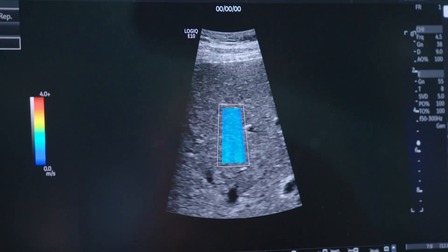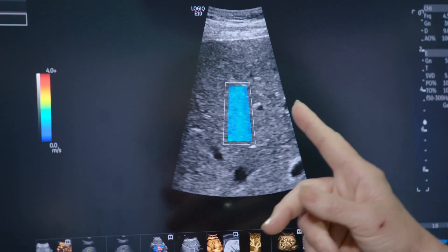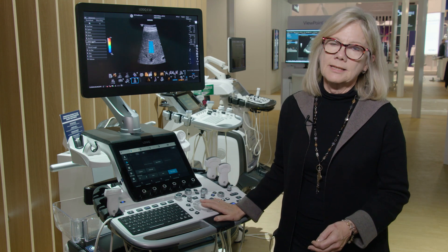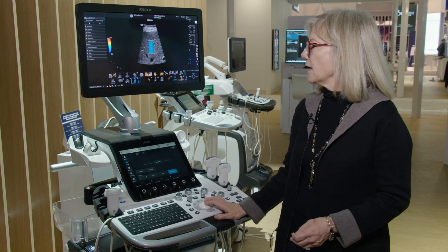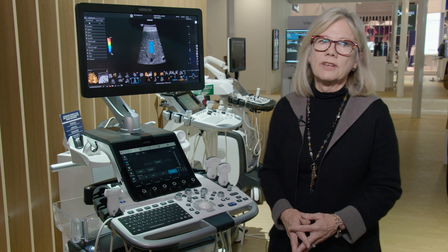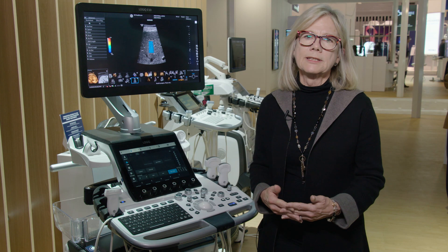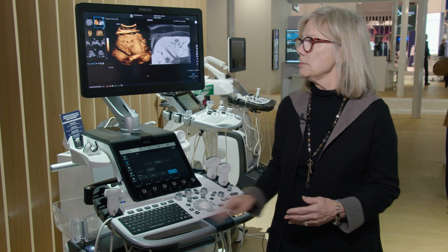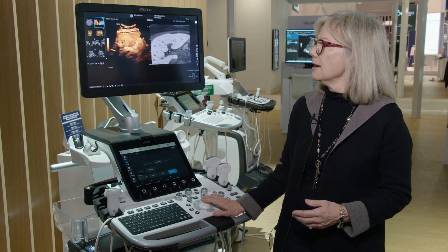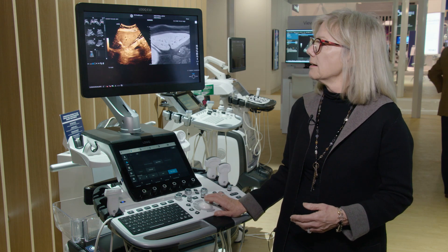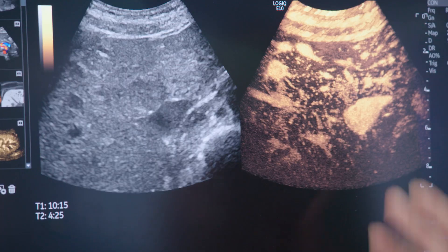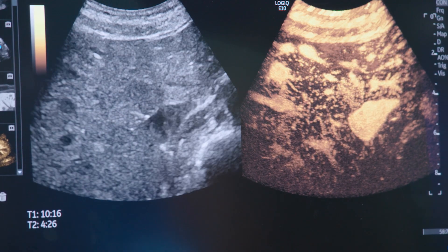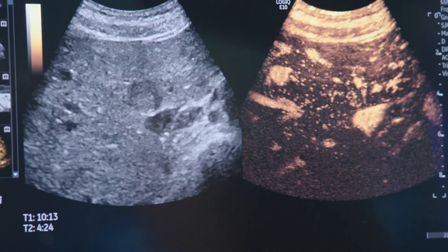For assessing chronic liver disease, we employ shear wave elastography. As you can see here, we have a qualitative map and a scale for the kilopascals and velocity. Another tool that we have is volume navigation, where we fuse a previously acquired CT or MR image with today's current ultrasound image to evaluate lesions. And then another tool is contrast agent imaging, where we track contrast agents coming into the liver to assess liver lesions, whether they be benign or malignant.